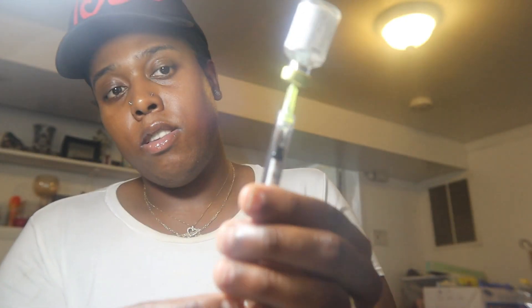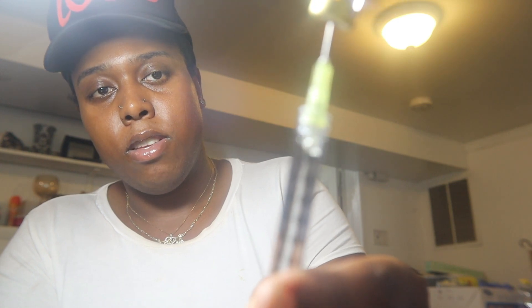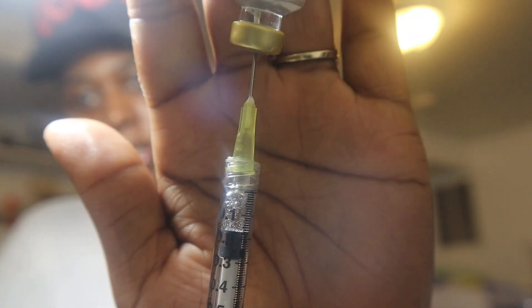Be careful — place the needle cap aside. You can place the vial on a flat surface, but I like to hold the vial in my hand. If you're doing it the way I'm doing it, please be careful so you won't stick yourself. Slowly put the syringe into the vial, lift it up, and begin to draw the medicine out. Slowly pull back the plunger and watch the medication come up.